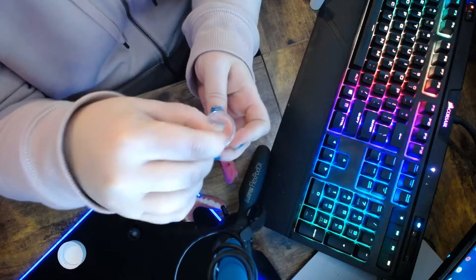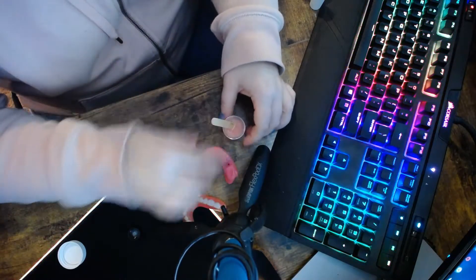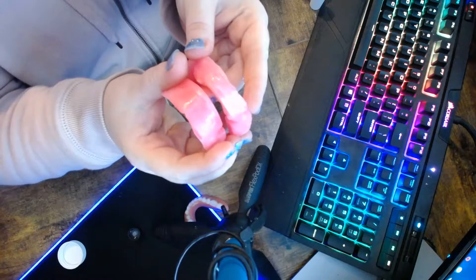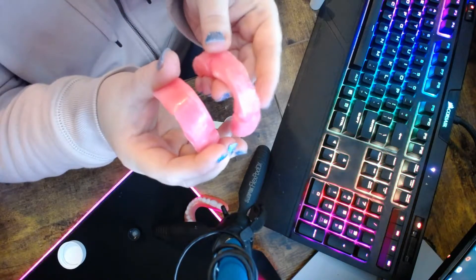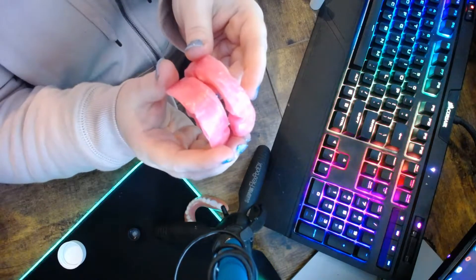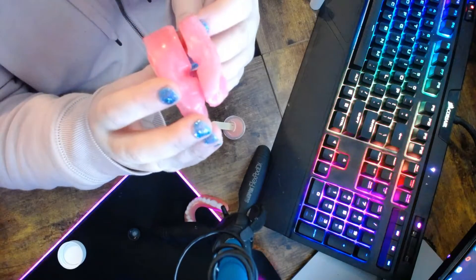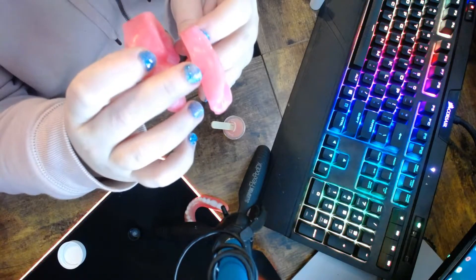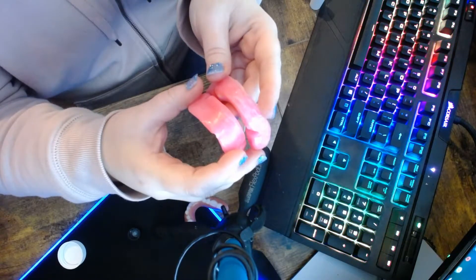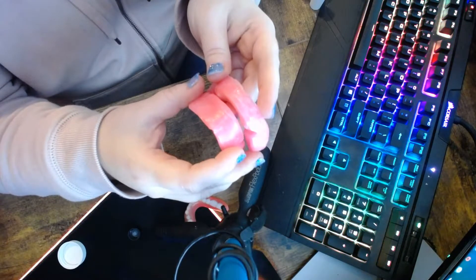Once it starts to set, that is perfect for using it. I'm going to let that sit for a second and show you with my bite blocks. Whenever they go into my mouth, they're going to be like this, because the lower one is just a little too short. I'm going to let the ProSoft flow through that gap and flow through the key holes here — see the keys? Here and here, and same on the other side. That's going to act like glue to stick them together and give Jamie an idea of what my vertical dimensions look like.